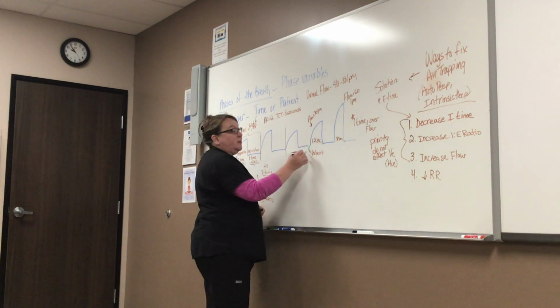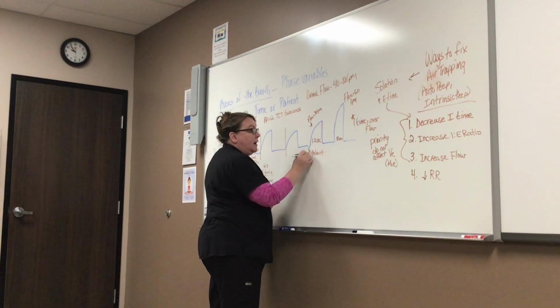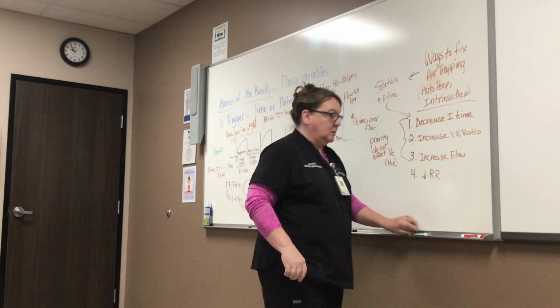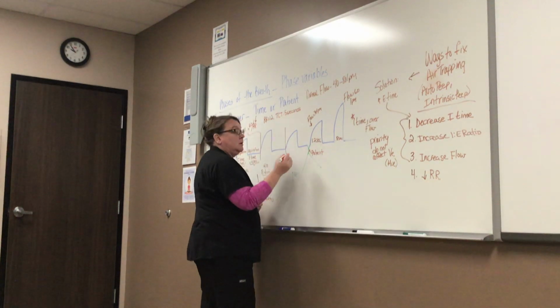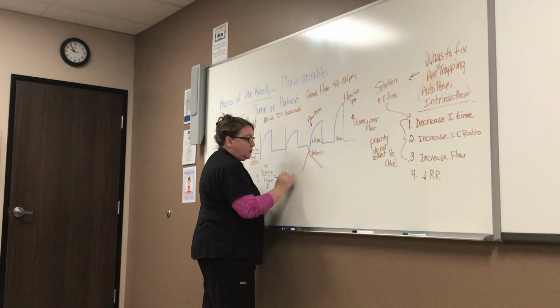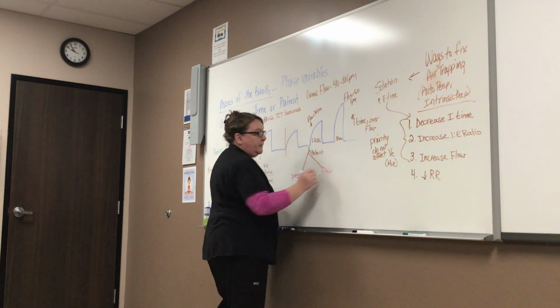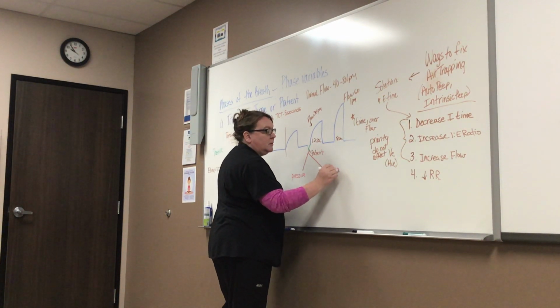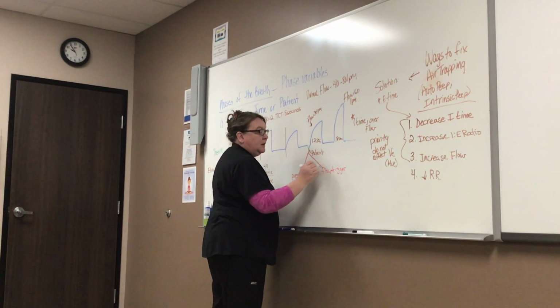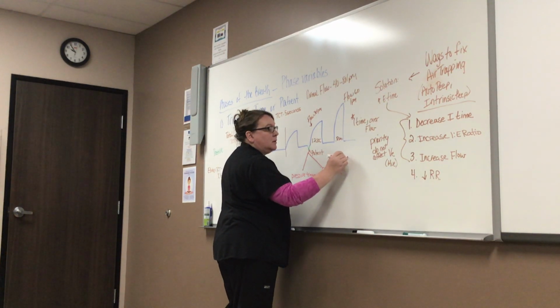My patient triggered breath here can be pressure or flow triggered. This is also known as the sensitivity.